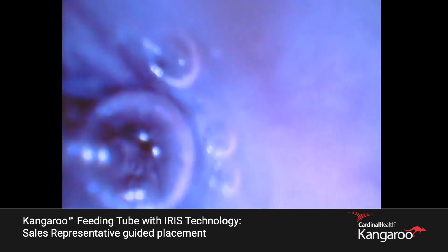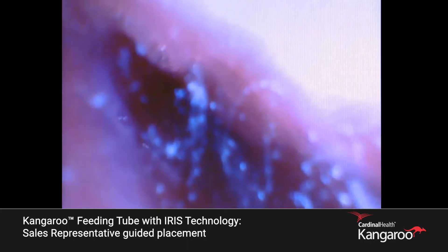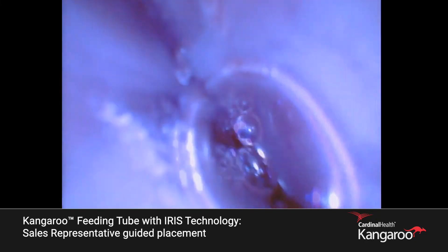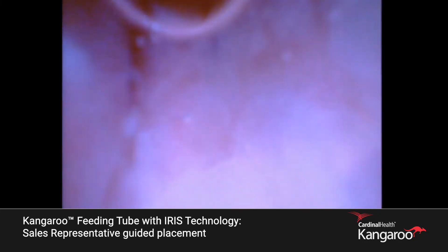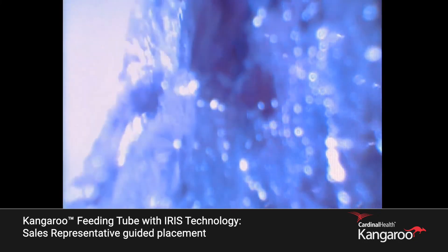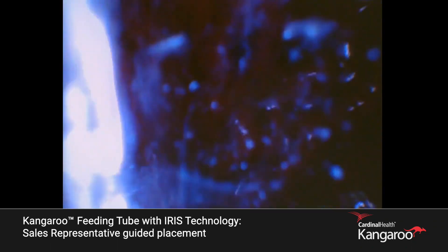You can see the smooth, collapsed nature of the tissue. Let's go ahead and slowly advance through the esophagus — great job. We're entering the stomach now. Let's come back a centimeter and look at the rugal folds here — great image.